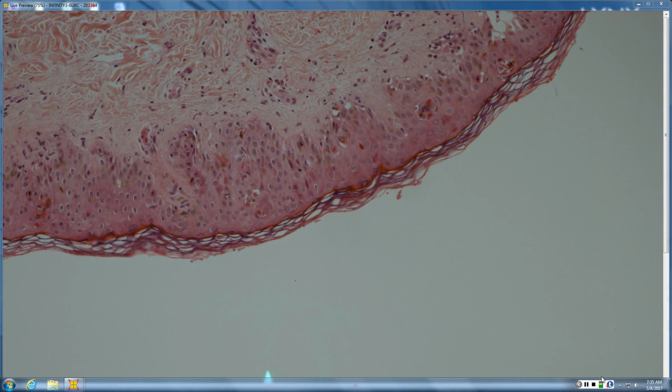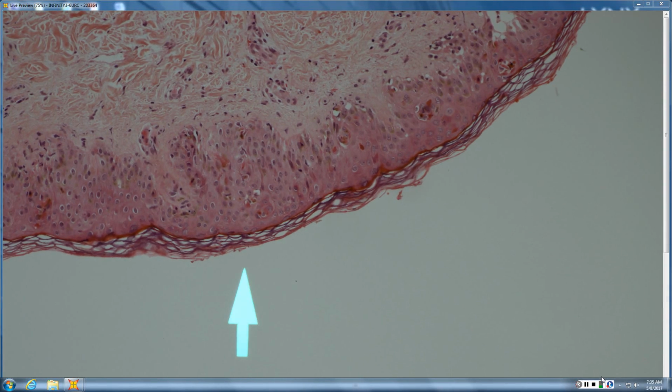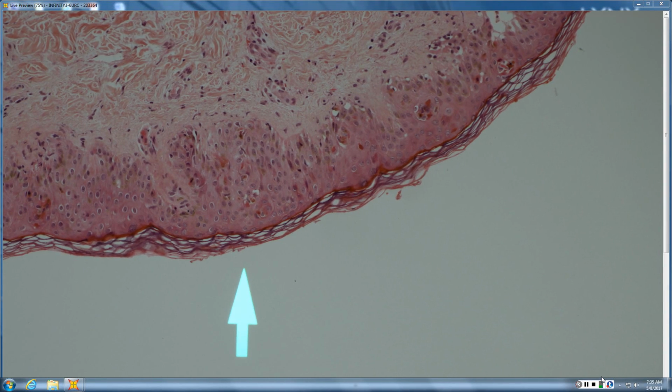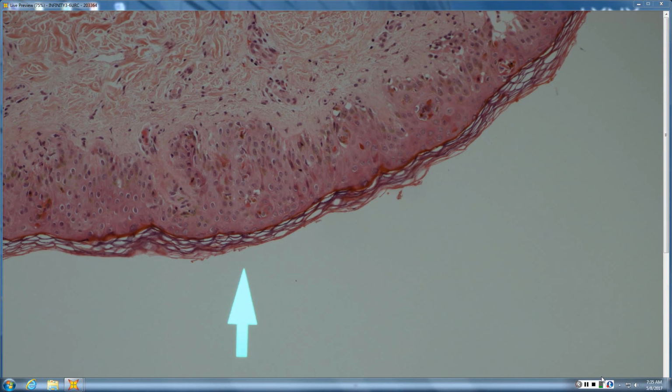So let's go back to the corneum real quick. You said compact. Is it compact like pathologically compact or compact basket weave like dorsum of hand or foot compact? The latter. So just orthohyperkeratosis. Yeah. So probably normal for anatomic site, but suggests maybe acral. Acral but not volar. Yeah, because it retains its basket weave, but it's a little dense.